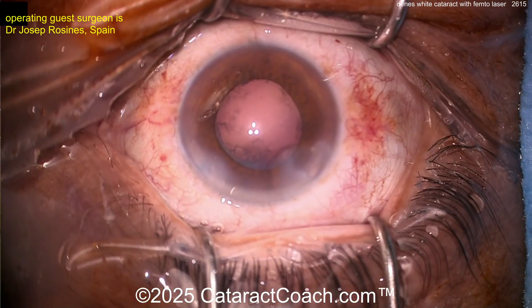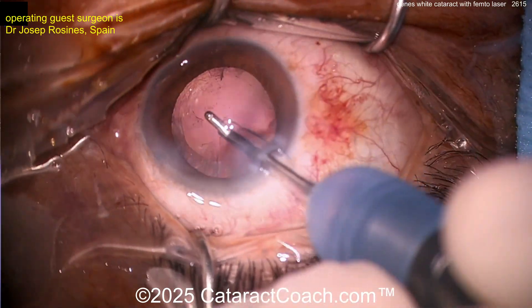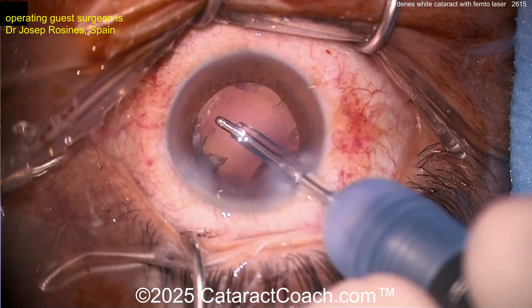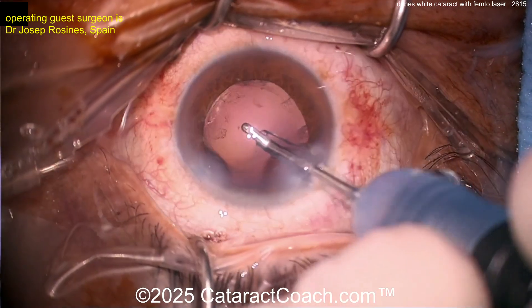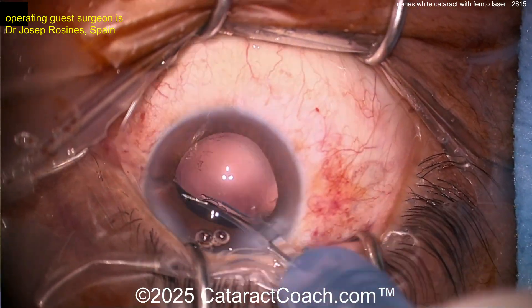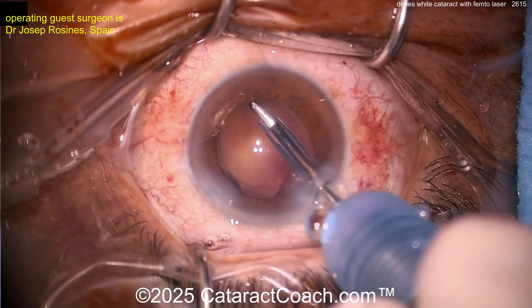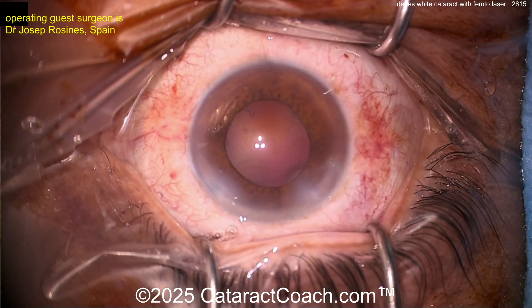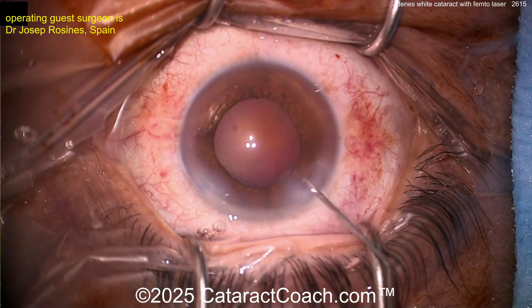It's interesting — even though a femtosecond laser was used for the capsulotomy, it wasn't able to penetrate the opaque lens, so it wasn't used to break the lens up. Also, the femtosecond laser was not used to make the incision. I agree with this surgeon that femtosecond laser incisions for the main incision are not ideal — I'd rather do it with a diamond keratome or even a steel keratome, which makes a nicer incision that seals better than a femtosecond laser phaco incision.